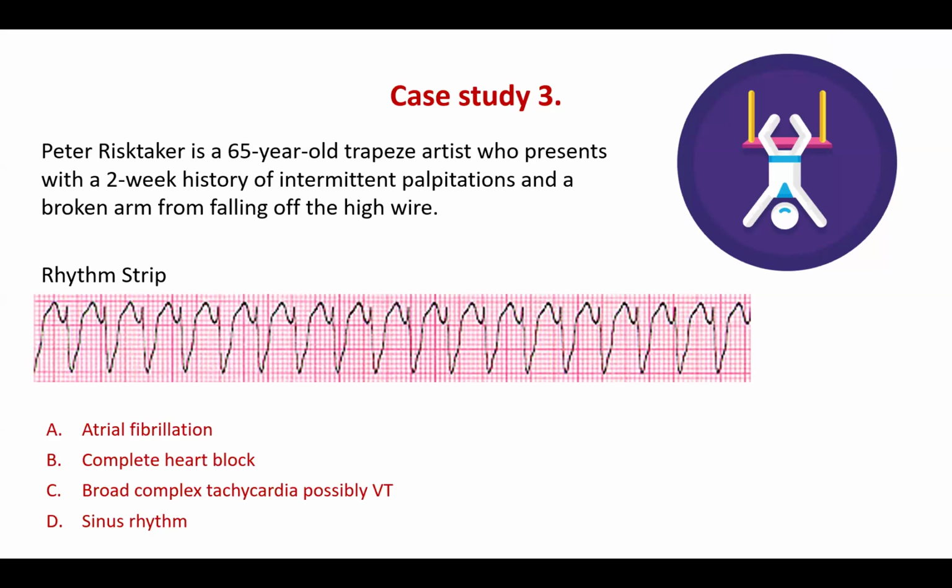Thank you. Another one around the placement of the leads: are the lower limb lead placements on the lower abdomen affected by a large abdomen or abdominal apron? Yeah, the lower abdomen's fine. If you get someone who's really obese and has a large apron, it's similar to the breast question, really. You've just got to see what makes sense. The right arm and the left arm are going to be quite straightforward with most people. But if you've got a very obese person, sometimes it can be difficult. You just want it to be low enough that you're below the heart. Most people you're not going to have a problem with, but people who are particularly obese can be problematic.